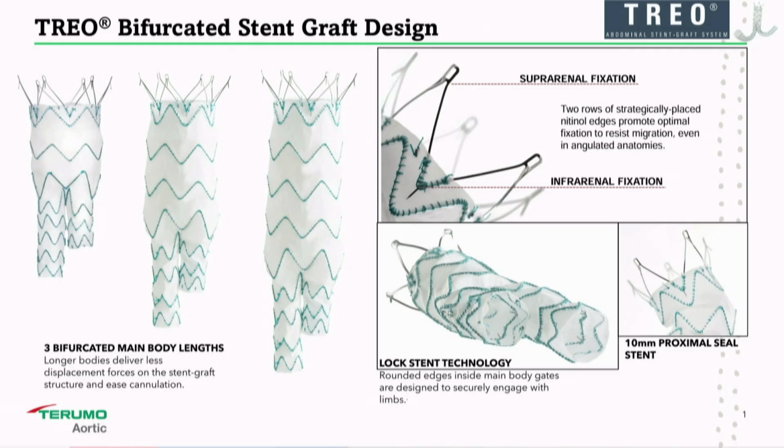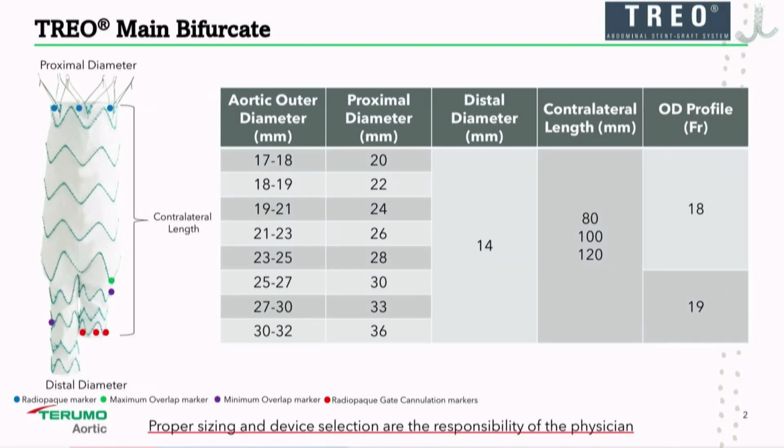So you can have a short body, long body, and I think in most of these cases, the longer body has made this graft more accessible to treating complex abdominal aortic aneurysms, including PMEGs too. In addition to that, it also has a locking stent technology in the limbs, and so there's very less likely chances of a separation and type 3 endoleaks. So I'm going to go ahead, and we will then present this case. Go to the next slide.